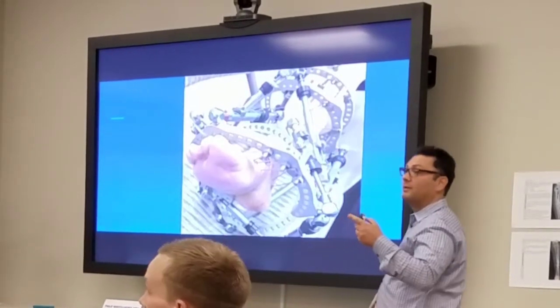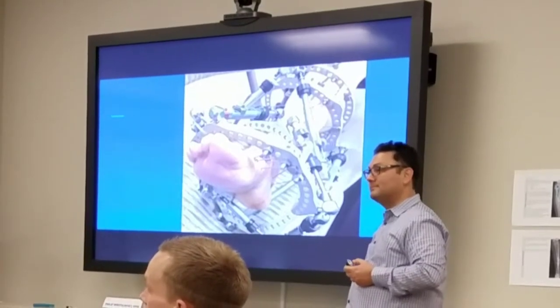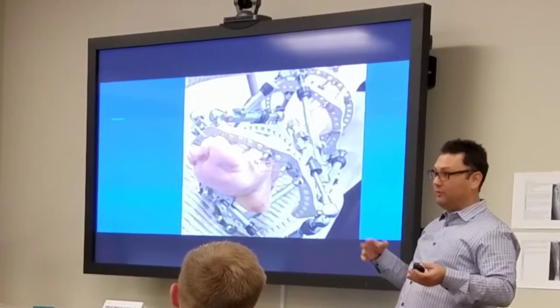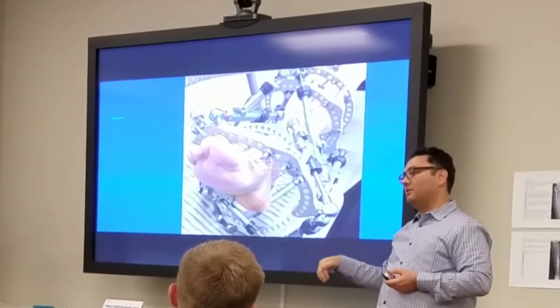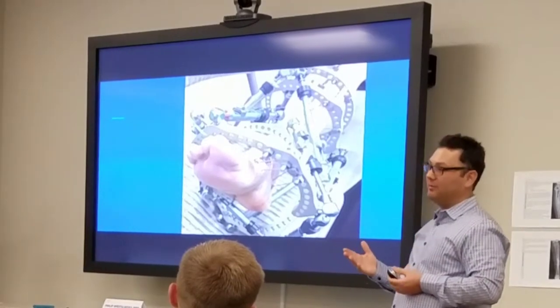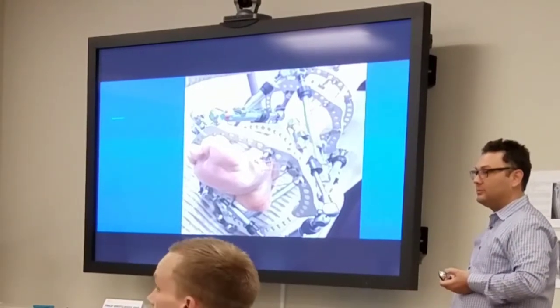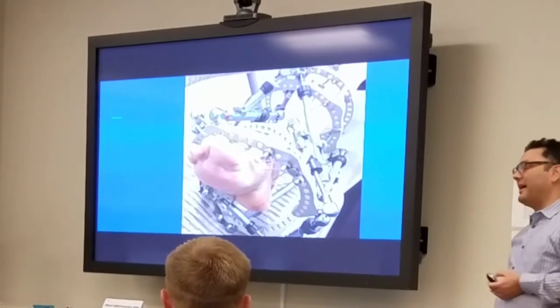Go ahead. I have a question. Don't you want to go in with a small incision and plane off that cuboid, because most of the time it's the culprit? You can, and there is data on which one to do, but you can plane off that cuboid and they're still walking on it, and it can still continue to bleed. It does help sometimes to plane it off, but it's better to get the correction and get the foot functioning more properly. Yeah, that too, but just to get yourself in front of the eight ball a little bit. Yes, I do recommend that.